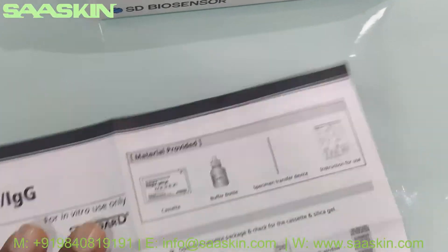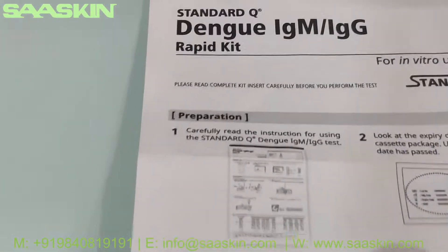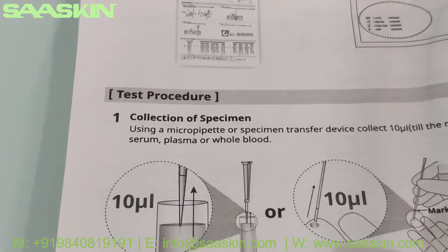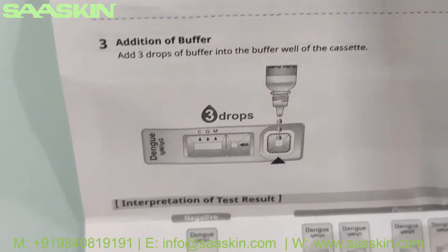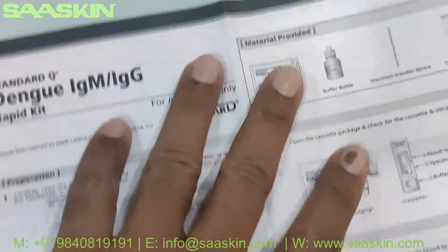The instruction for use covers the preparation of the sample, the testing procedure, and the interpretation of the result. This is the standard instruction manual.